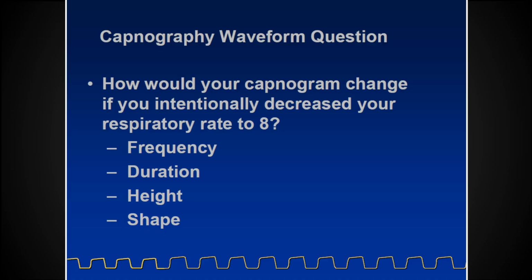They'll have more space between. Is she right? Yeah, snap your fingers with me, right? Okay, now slow it down. Right? They're spacing out more. So our frequency: you could look across the room at a monitor and see a slow waveform and know you got a major issue, right?